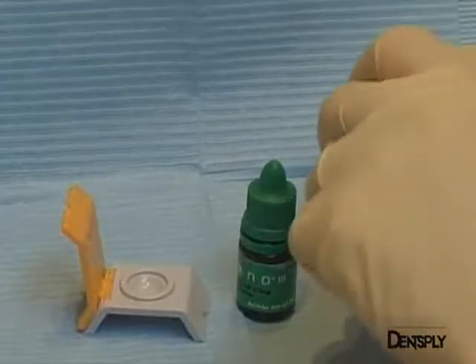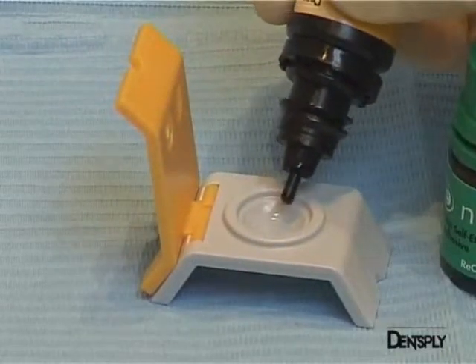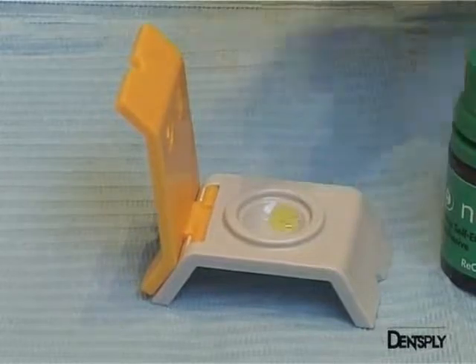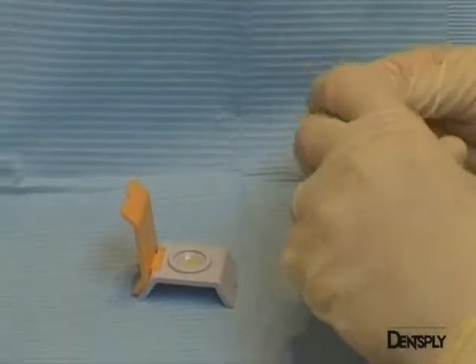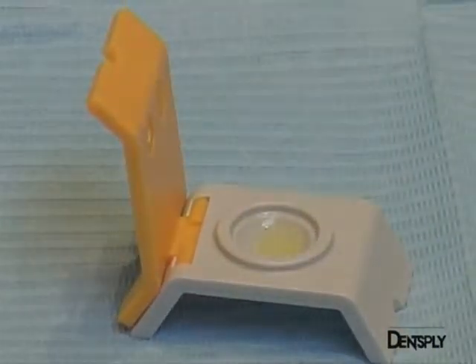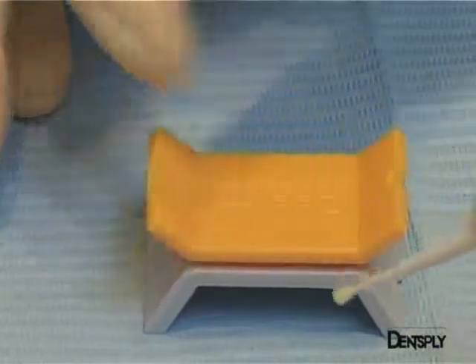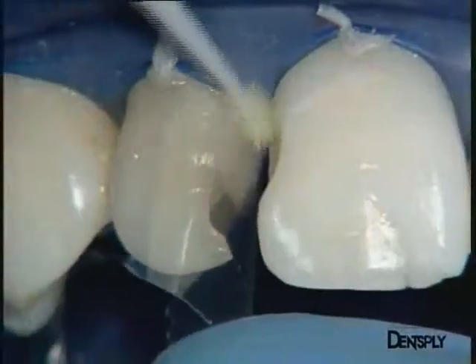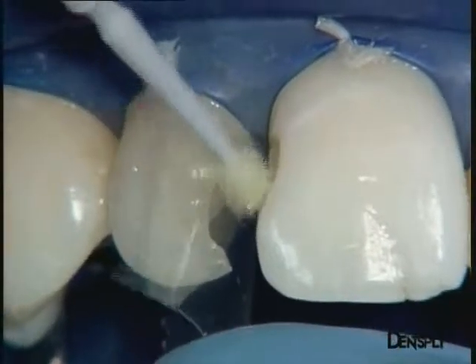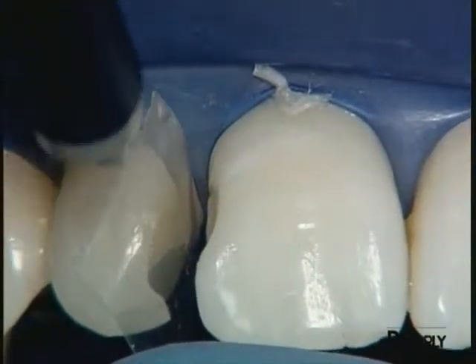After shaking the bottles to mix the monomers and the solvents, we take a drop from each bottle. The two drops are then mixed to give one material with which the hybrid layer is made in a single step. This adhesive is self-etching, enabling it to form a mechanical and adhesive bond with the substrate, leading to the formation of a hybrid layer. The adhesive is placed on the tooth and allowed to penetrate for 20 seconds. A gentle air blow eliminates excessive adhesive and we can now proceed to the light curing with the SmartLight PS LED lamp.